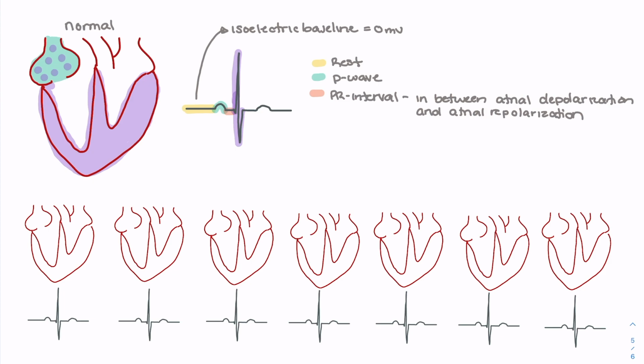So the QRS complex is showing us that we have depolarization of the ventricle and repolarization of the atria. So we are seeing flow of electricity because we're having the depolarization of the ventricle and the repolarization of the atria. So now as we get to our next isoelectric baseline, again, it's not that the heart is at rest during this period, it's that we're in another of those in-between periods.